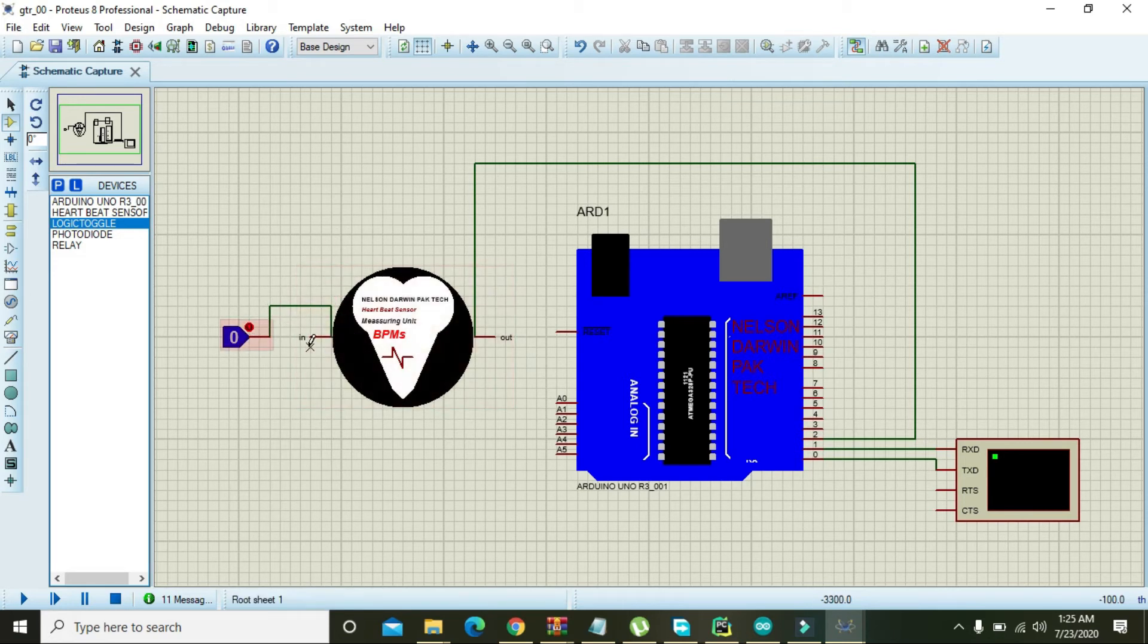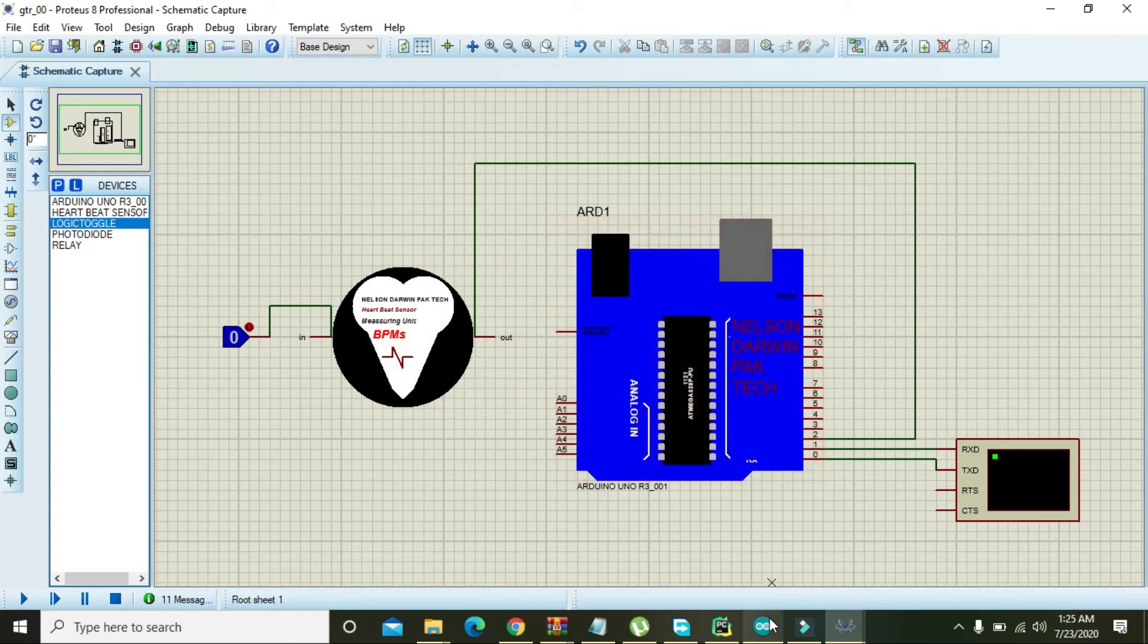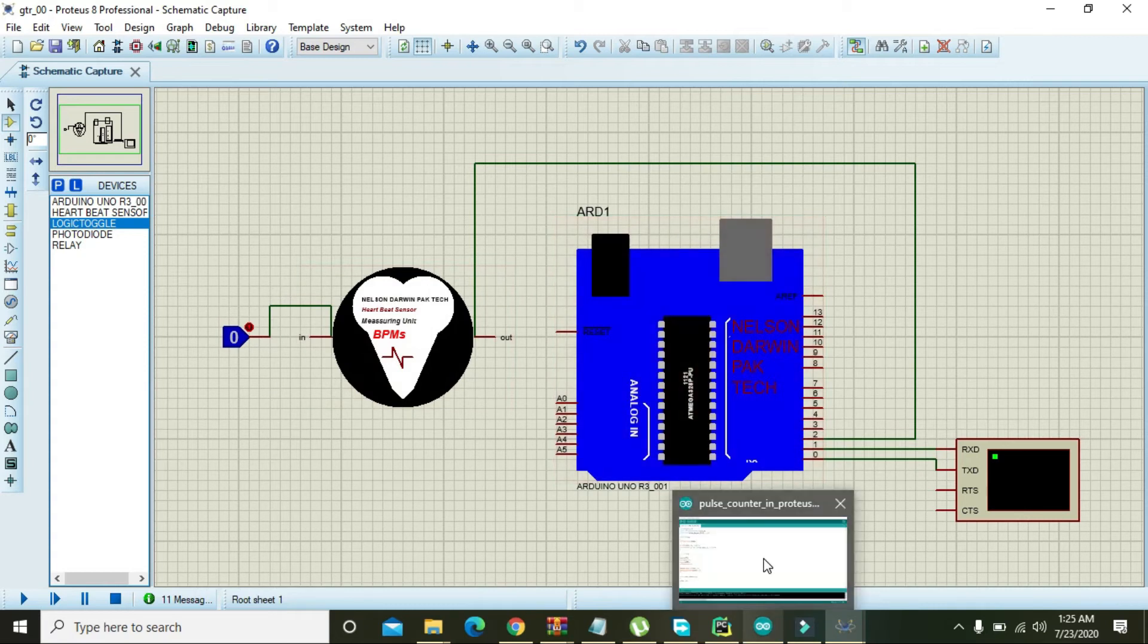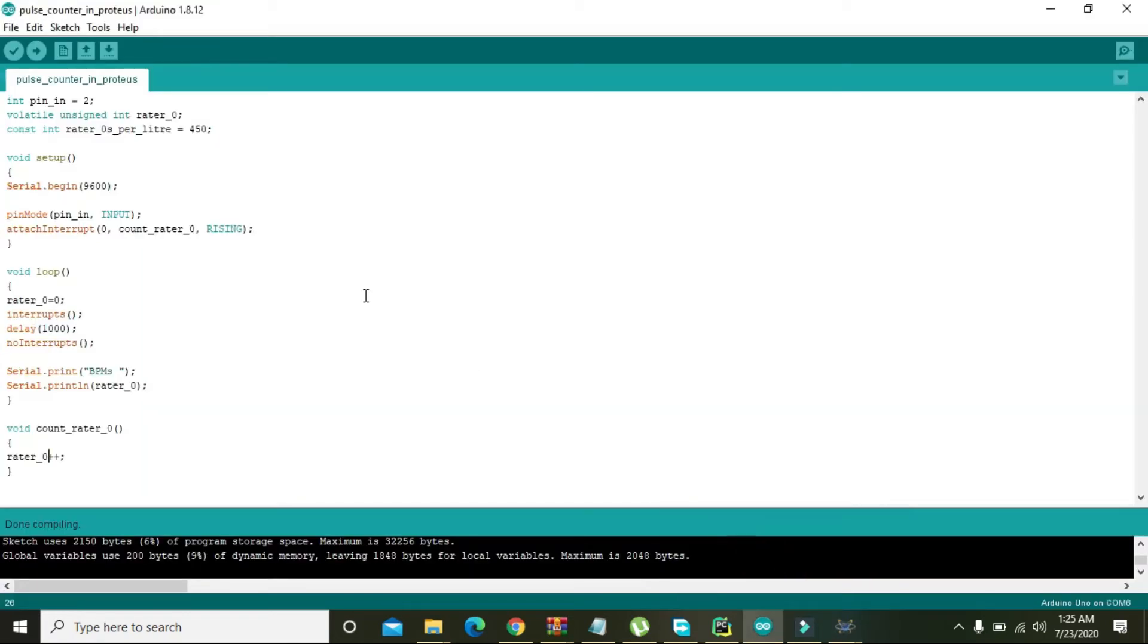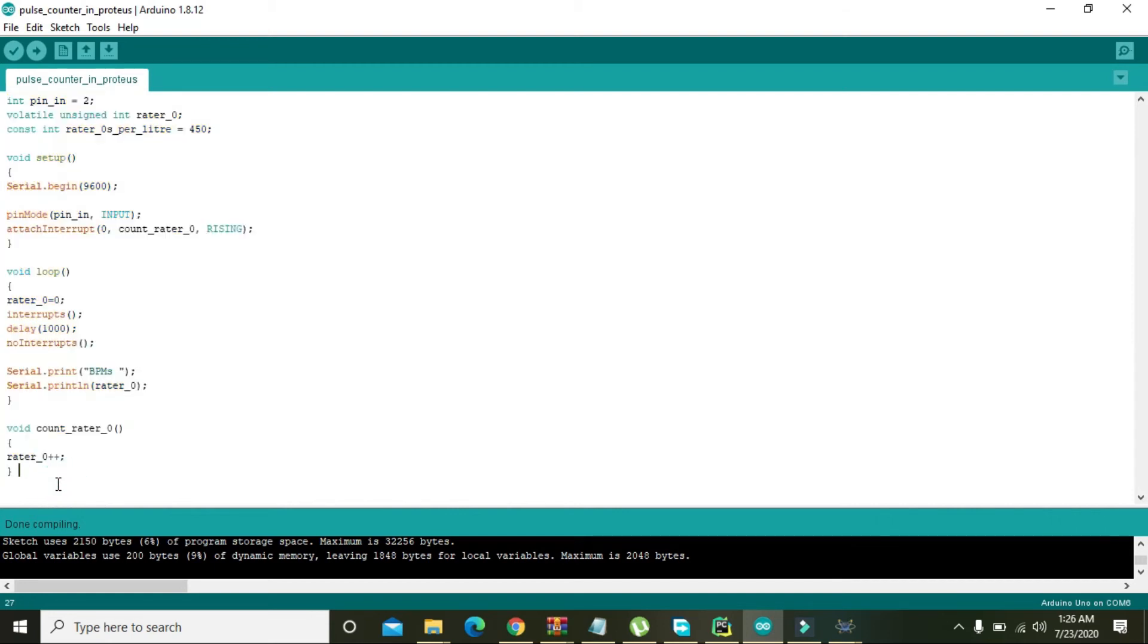So now we will go to the code we have made. So this is actually an interrupt-based code. You can see that in it on pin number two interrupt is listening to the pulse entering. Although we can do it without interrupt, but interrupt is very good because the controller is listening properly the signal that is on interrupt pin.